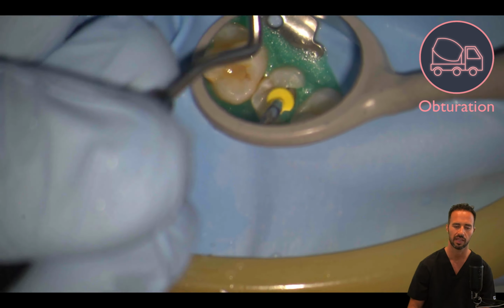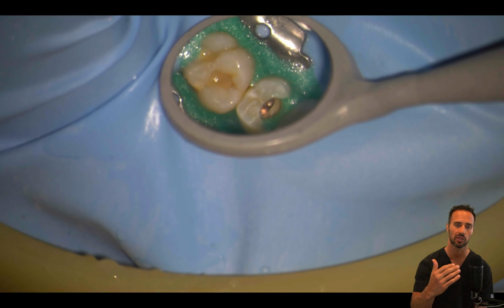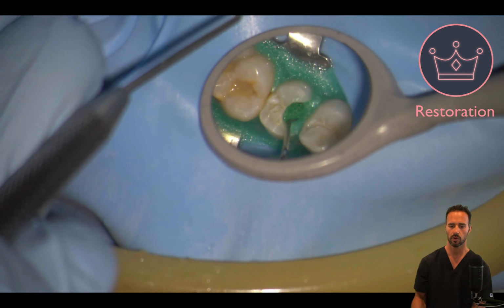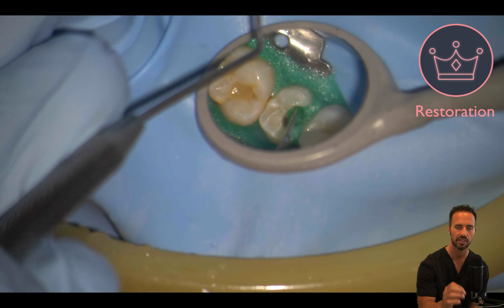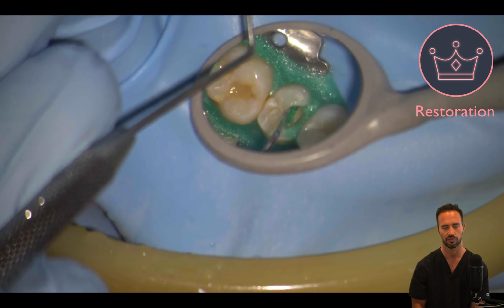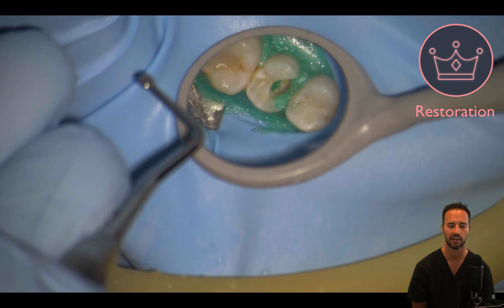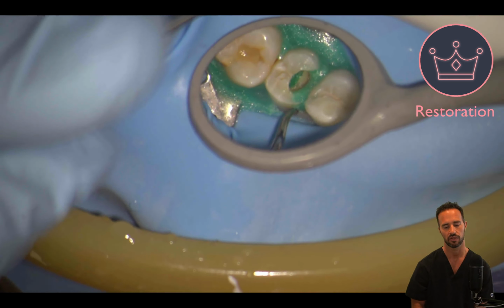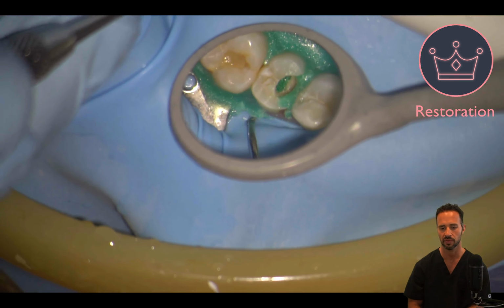And now I'm just kind of making sure the gutta percha is flat at the depth of the post space and at the buccal canal orifice as well. All right, that looks good. So now we're going ahead and dealing with our temporary restoration by placing our green sterile sponge. But like I mentioned, if you'd like, go ahead and perform your definitive restoration here by first removing your opal dam, and then either placing your Tofflemire matrix or your composite ring and restoring.